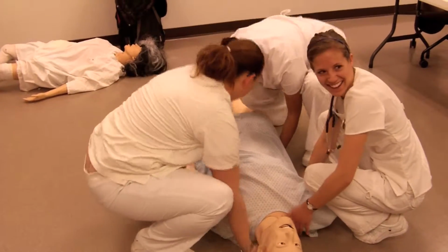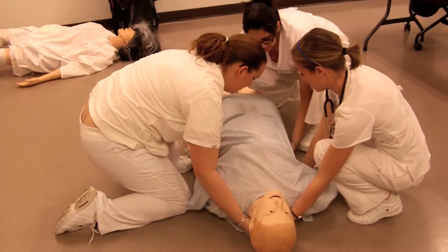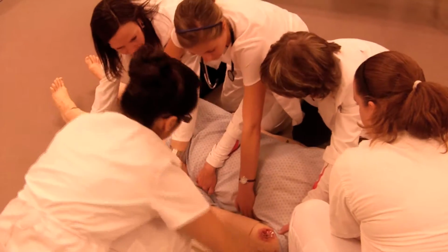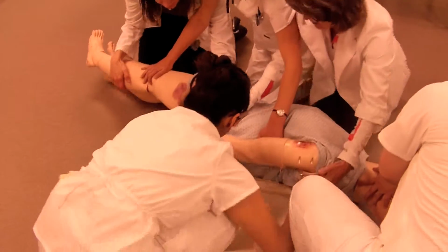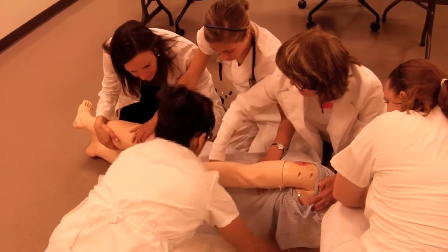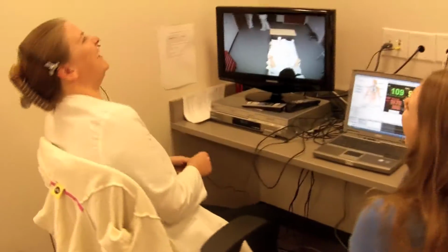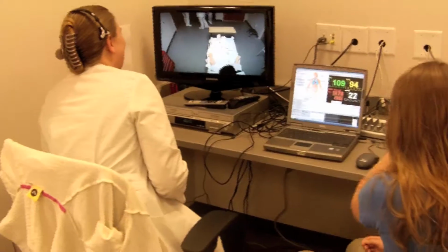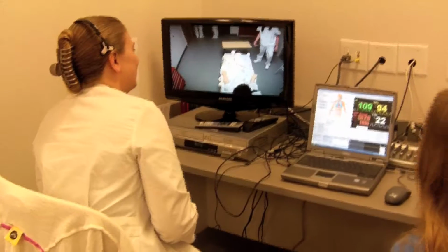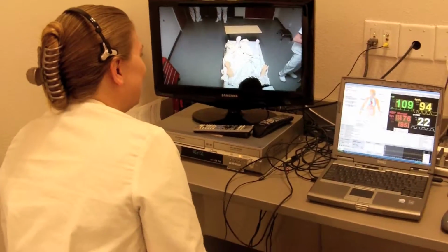Oswald can talk. Oswald breathes, has a heart rate, has sounds in his tummy. His eyes can dilate, his lips can turn blue, he can sweat. He also can simulate his symptoms internally. So, for instance, maybe he's a poisoning victim and his airway is constricted. If the students were going to go in and try and put a tube in his airway, they would have difficulty putting the tube in because his internal body would actually simulate the symptoms of what his illness is.